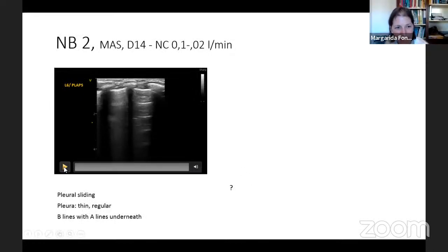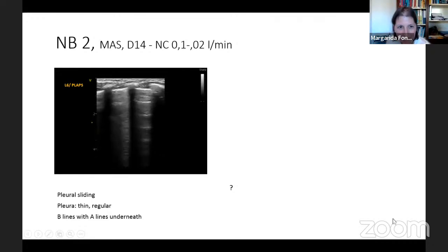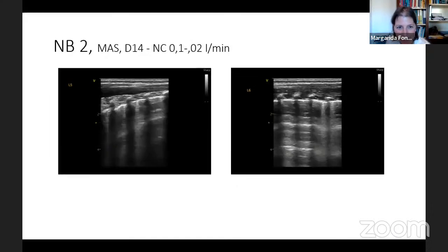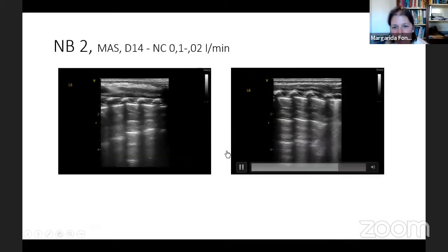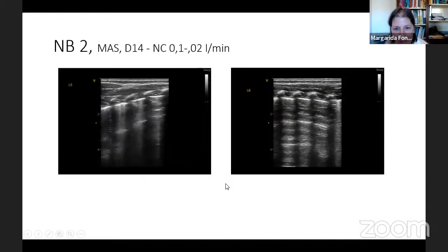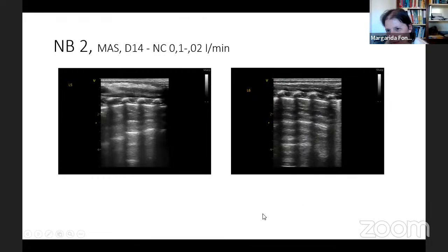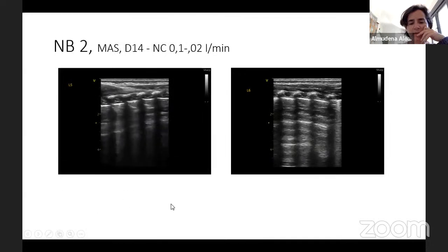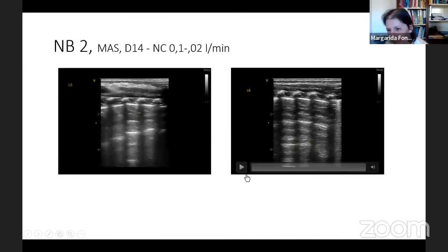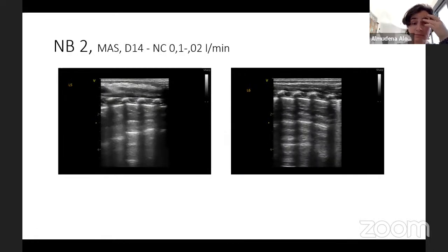Here I tried to raise the PLAPS sign, and it was okay. And here I tried L5, L6. I put some sharpening in, but I don't think the image got much better because it's blurred. And you increased the depth too. Yes, it's probably not necessary. What do you think? No.